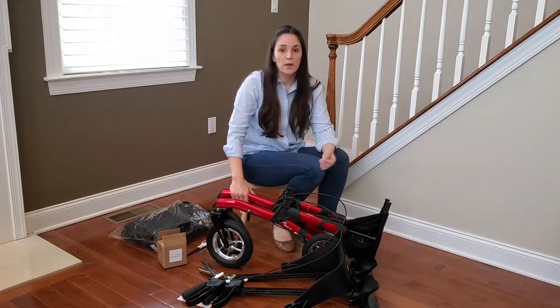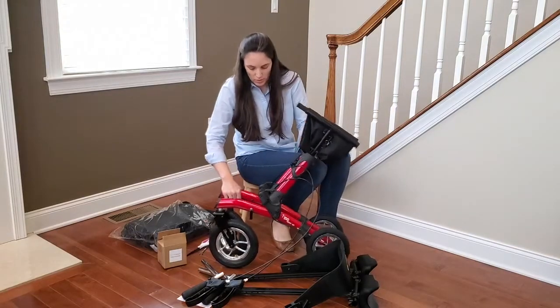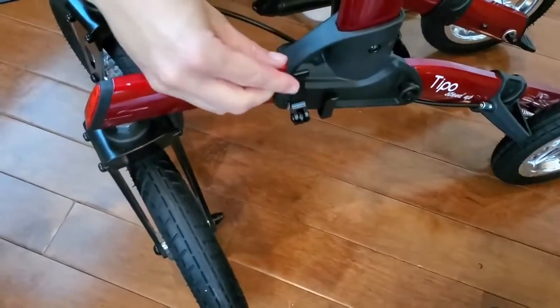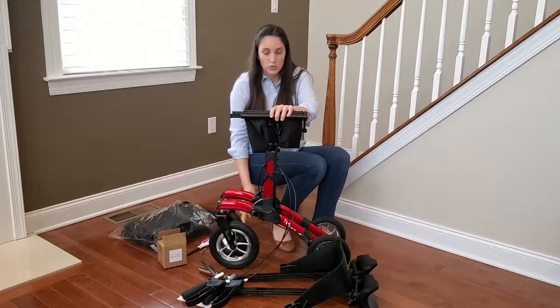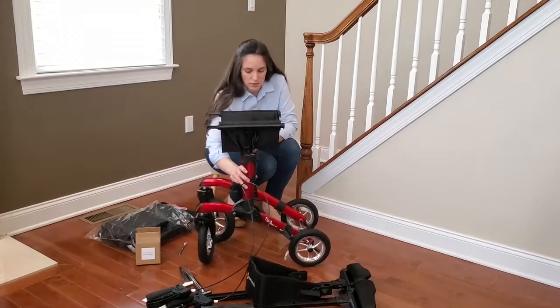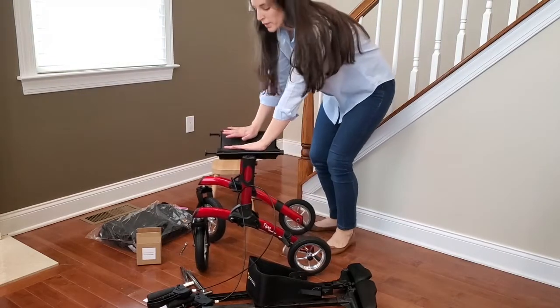Your first step is to lift the support for the handles on the walker, and then you have to lift the lever up 180 degrees and fold it towards the back wheels 90 degrees. You can do that on both sides. Now we're going to spread the walker apart and push the seat down until you hear a clicking sound.